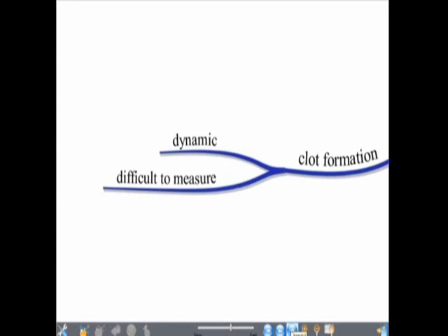But this is not a real indication of the patient's coagulopathy, because the blood started clotting ever since the sample was withdrawn from the patient, and ever since that point things have been changing in that sample, especially during the time it's in transit from the ITU to the lab, and then all the spinning and everything. It's a dynamic process, and it needs to be treated as such to get accurate results.